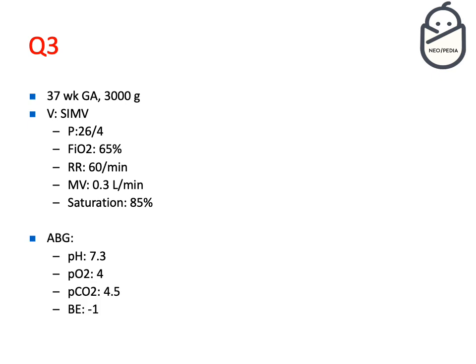So the gas looks, so there's low oxygenation in the gas here. PO2 is only 4 kilopascal, but your CO2 is 4.5. So what do you think here? You have a problem here?